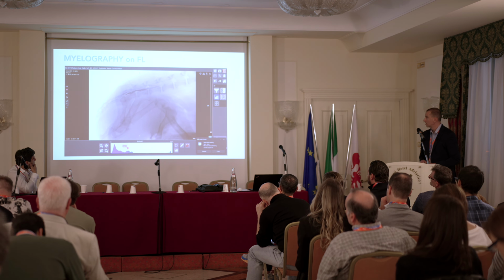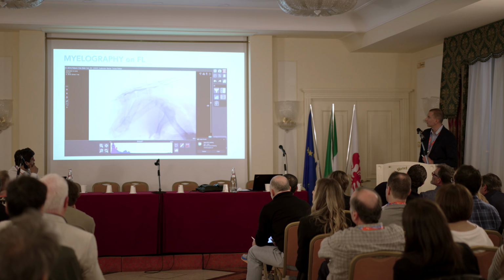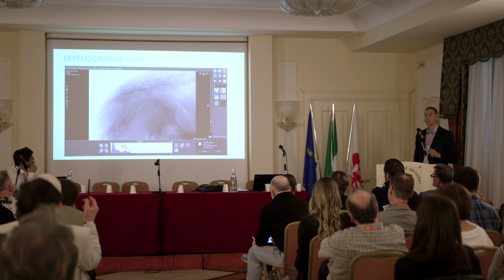So you can see how the contrast medium is going through the vertebral channel, and how nice pictures could be. For me, this is something what is time consuming. It doesn't make sense for some better diagnostic, but for some reason, if you are in troubles with application or catching the spot, the fluoro should be a solution how to perform.